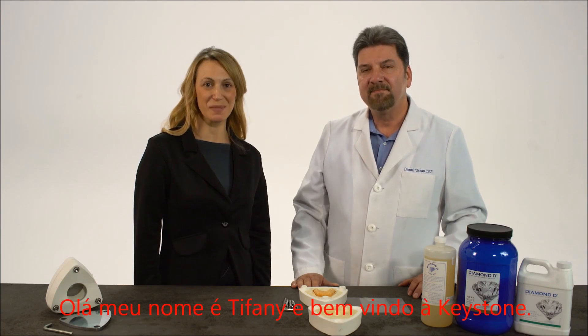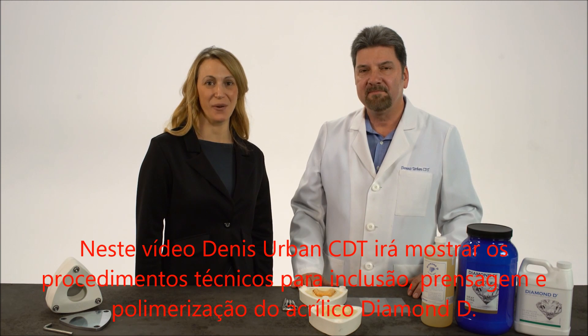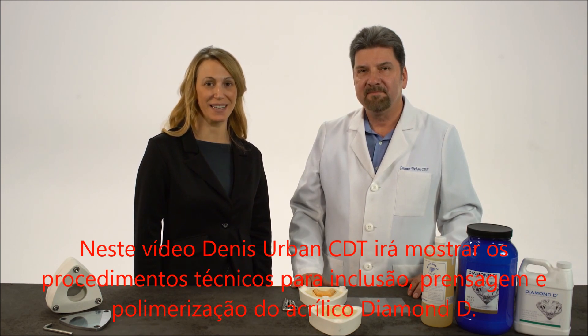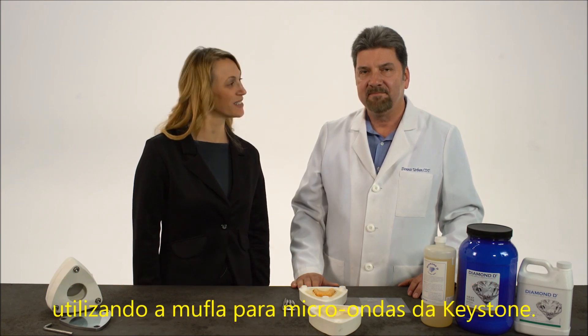Hello, my name is Tiffany, and welcome to Keystone. In this video, Dennis Urban's CDT is going to show you the investing, packing, and curing technique for Diamond D Denture Acrylic, utilizing Keystone's Microwave Technoflask. Thank you, Tiffany.